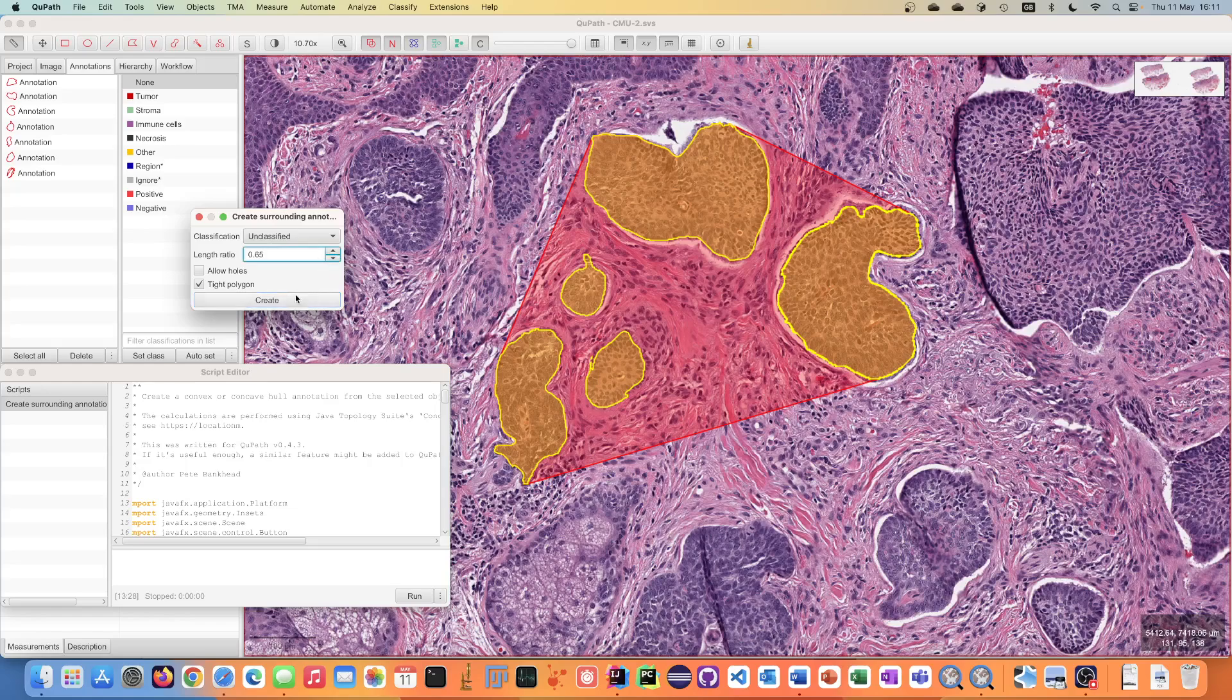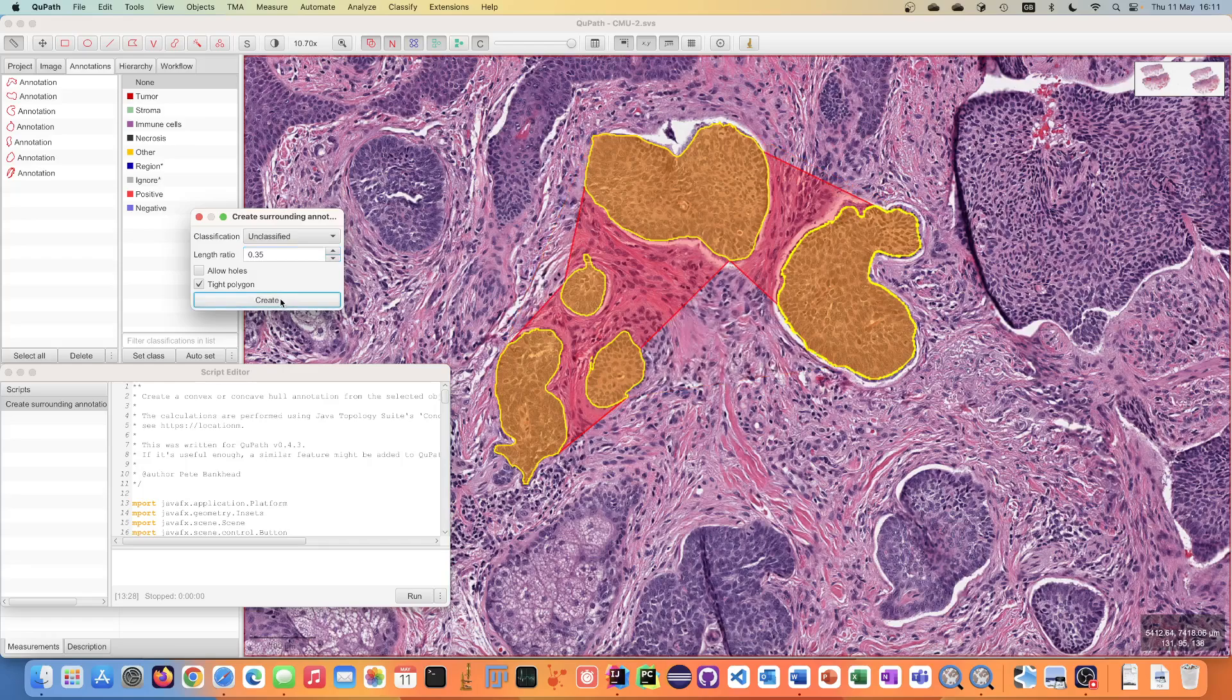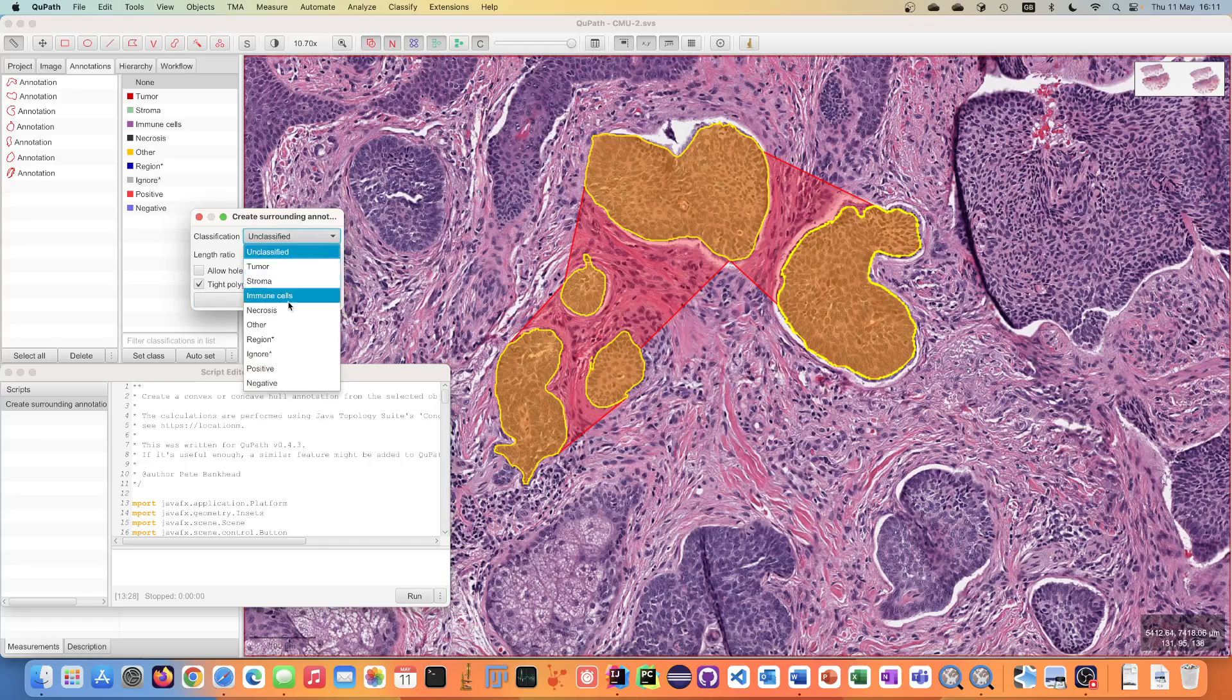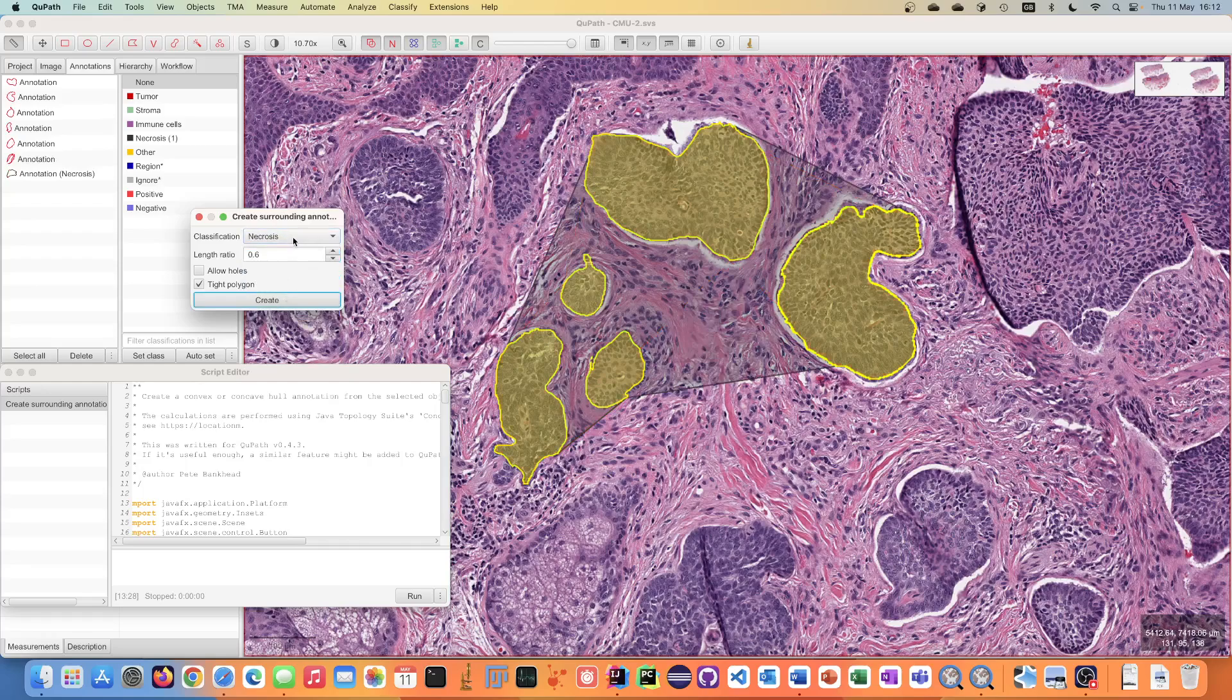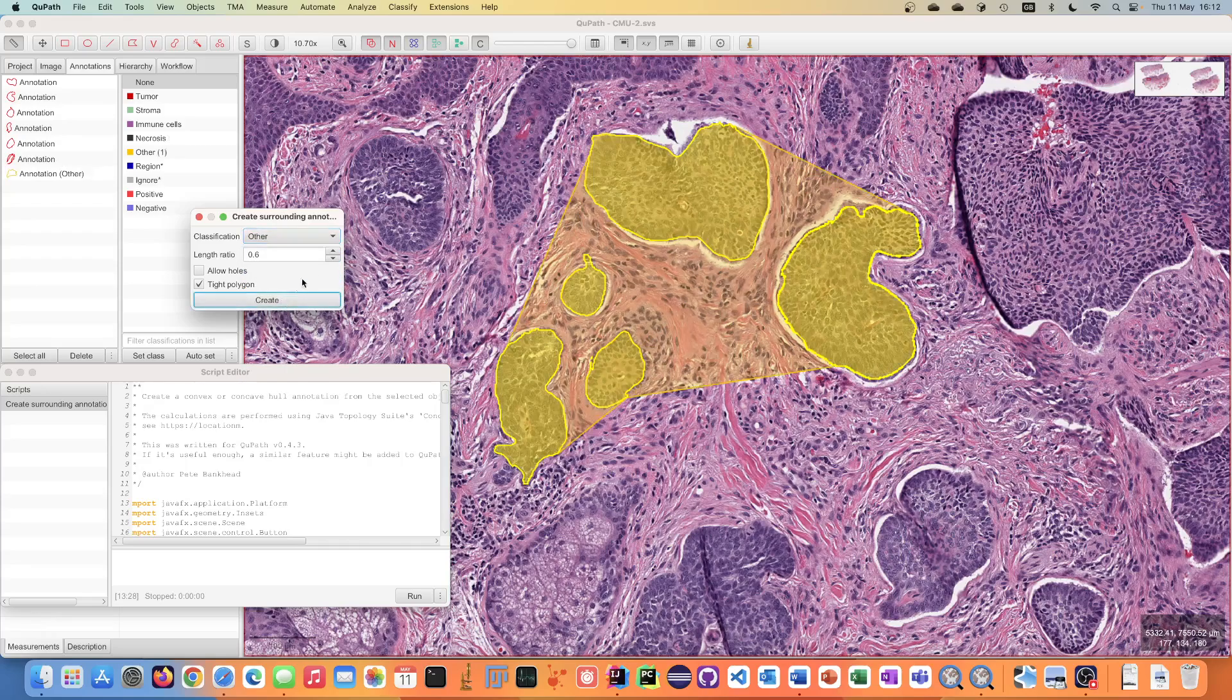So you can play around with the settings. You can see that if you decrease this you can see the impact it has on creating a smaller annotation, and you can change for example the class of the output.